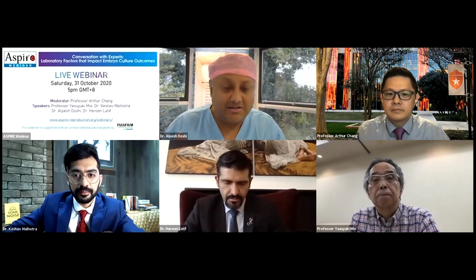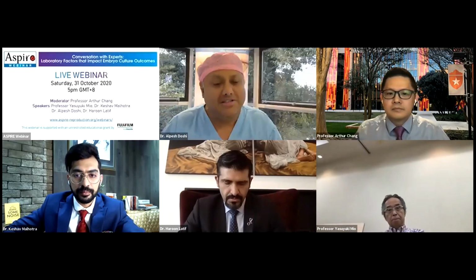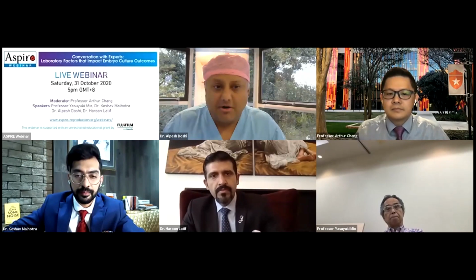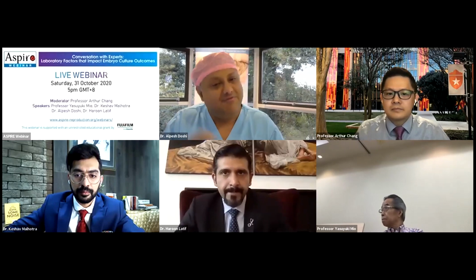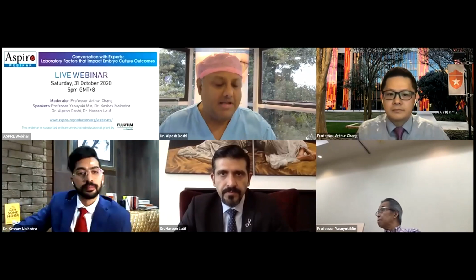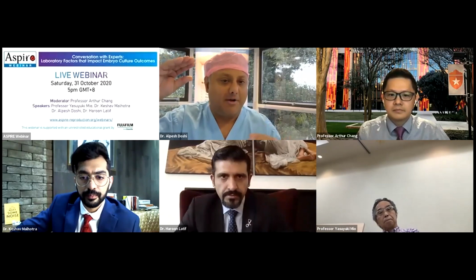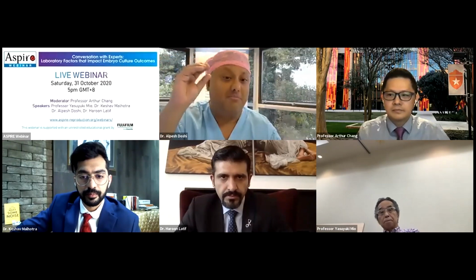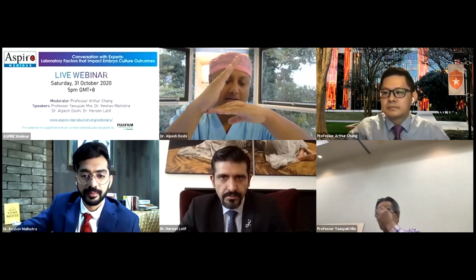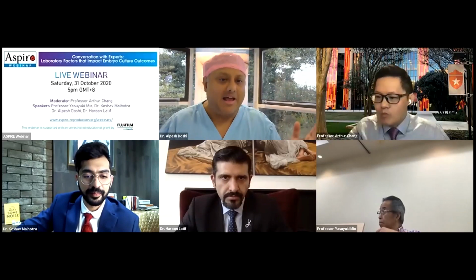So we need to treat it with a lot of caution, because embryos feel the heat and those cells can lyse as a result of the laser. So beyond a certain number of laser shots, if the cells are not coming out, it's easier to just flick. So what the flick means is that you release the embryo from the holding pipette, you hold the biopsy or the small amount of clump of cells that you have got in your biopsy pipette, and you use the holding pipette to shear off the cells and flick it, literally, as the name suggests.